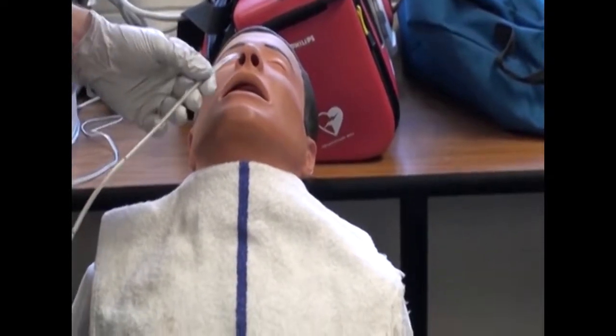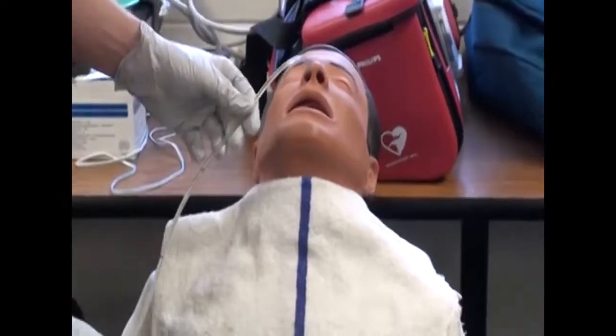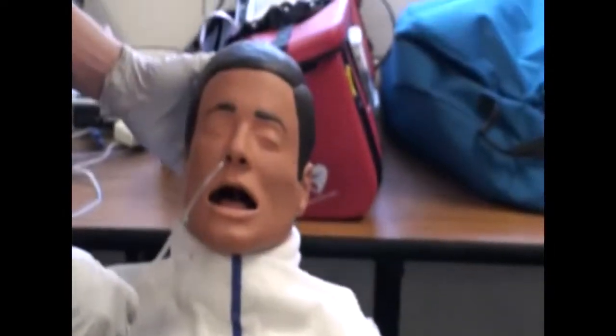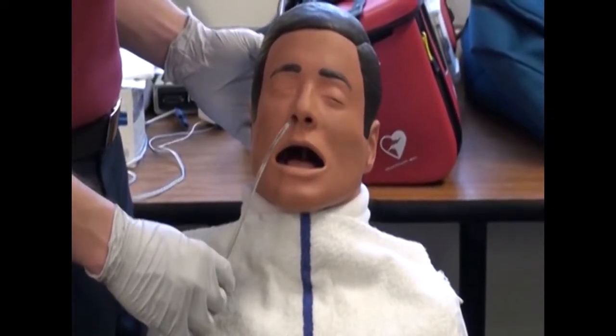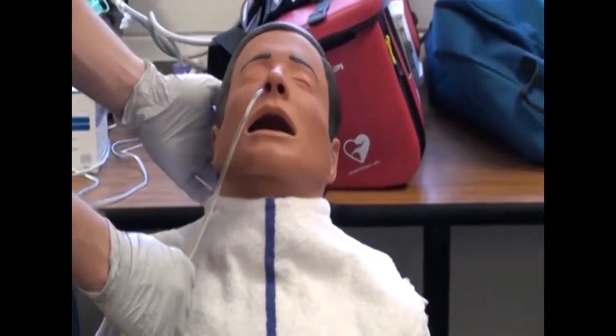Explain that next step requires him or her to swallow. Instruct client to flex head forward. Put the head forward, and dry swallow or suck in air through straw. Advance tube 1 to 2 inches with each swallow. Give him the straw. Zach, hold the straw up there.